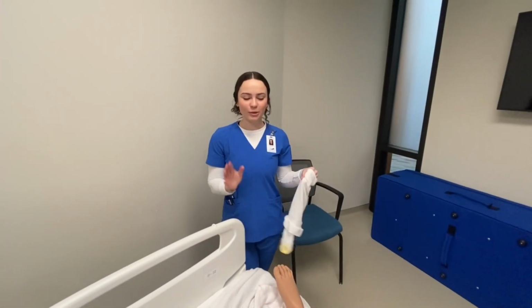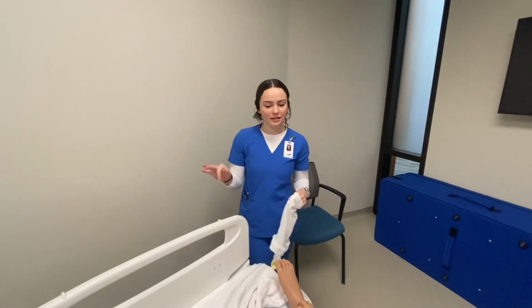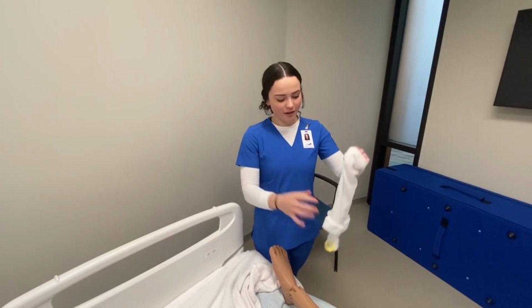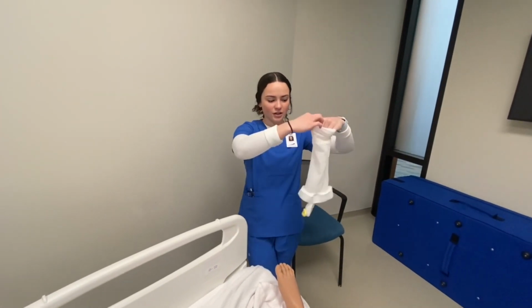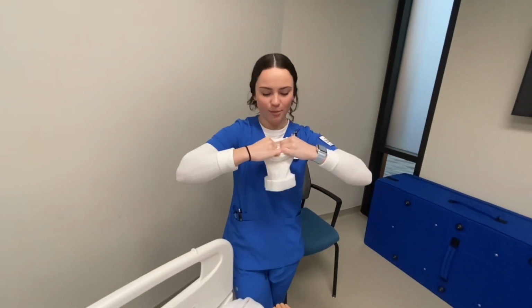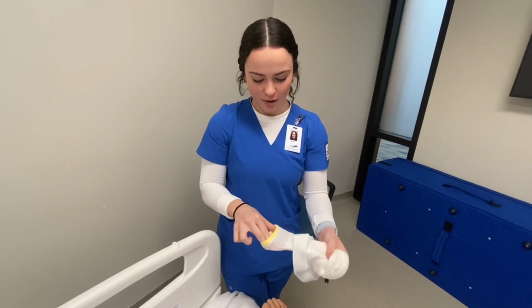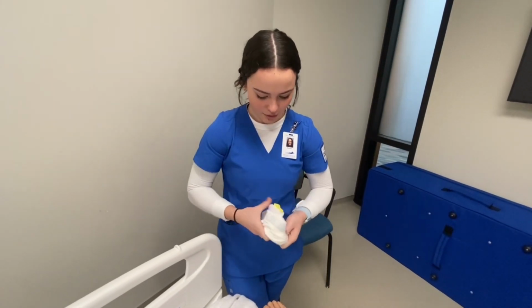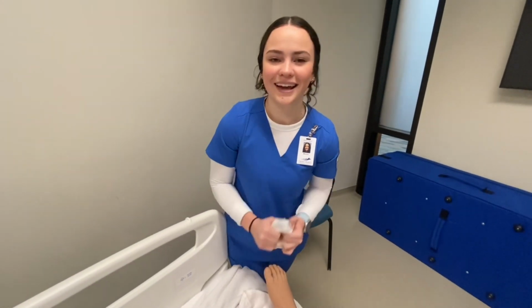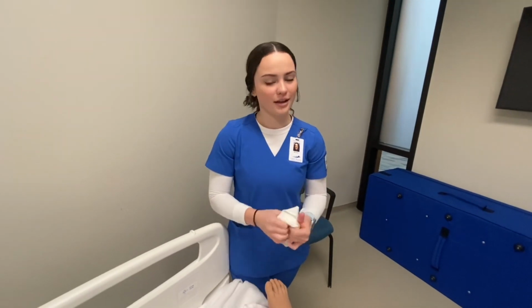So when you're about ready to put your TED hose on your patient, you want to do the same skin assessments that you would do for the elastic bandage and check for any abrasions, bruising, edema, all of the above. And you're going to start with your TED hose flipped inside out and over itself. And you want to pull it apart. They're a little bit tight, but you want to pull it as far as you can, keeping that toe box out so that it's easier to slip it right over the patient's toe. And then go ahead and stretch it over. And you want to do it as best as you can in one smooth motion and not snap it on the patient's leg.